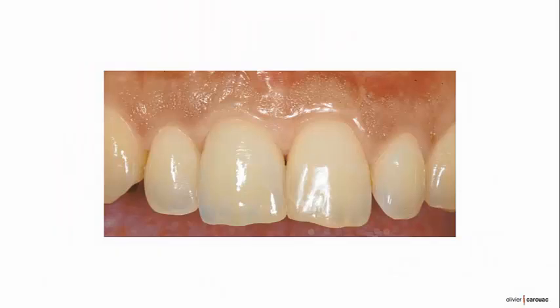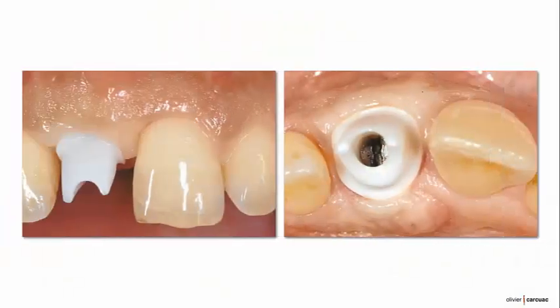Aesthetic parameters that have been defined for conventional dental restorations can also be used for implant patients during preoperative planning. These parameters can help define potential risk factors for the aesthetic shortcomings. The main aesthetic objectives of implant therapy from a surgical point of view are the achievement of harmonious gingival margin without abrupt changes in tissue height, maintaining intact papilla, and obtaining or preserving a convex contour of the alveolar crest.